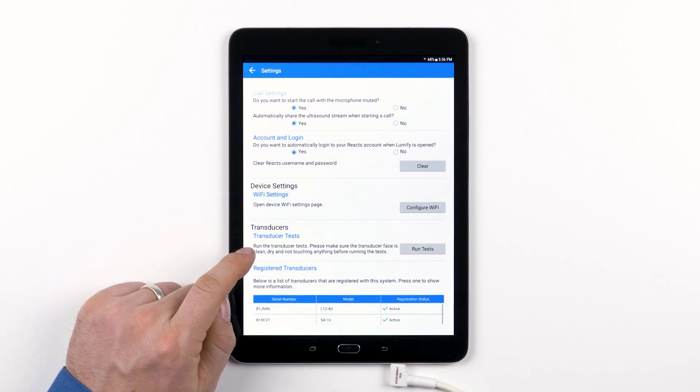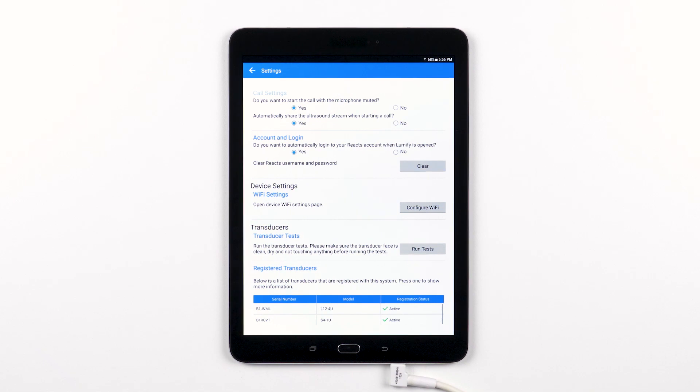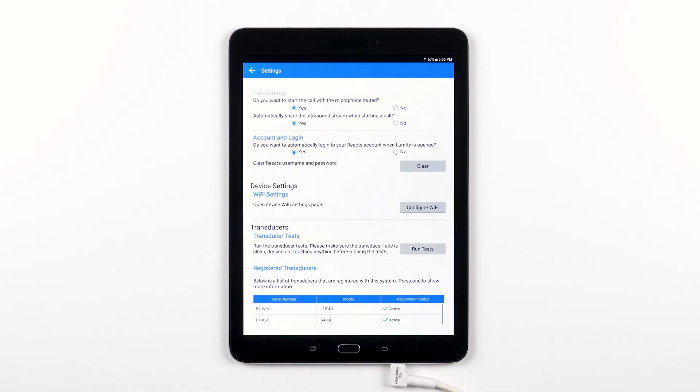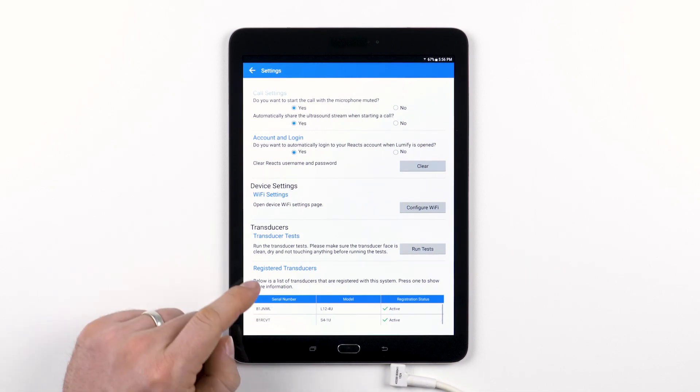The next section allows you to run a test on a Lumify transducer to check if it is working properly. If you suspect something is not as it should be, please feel free to reach out to your Philips service representative.